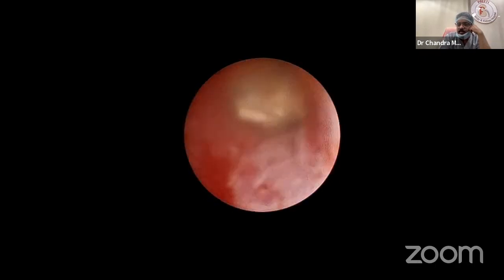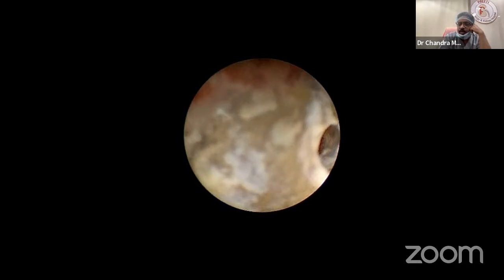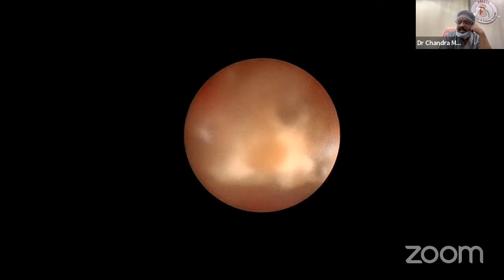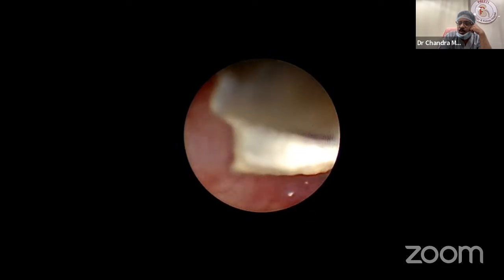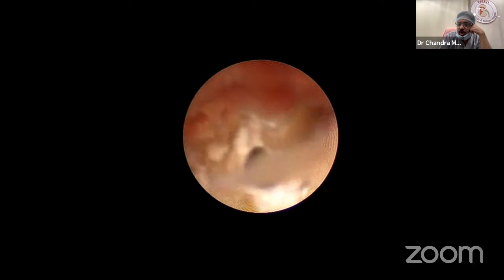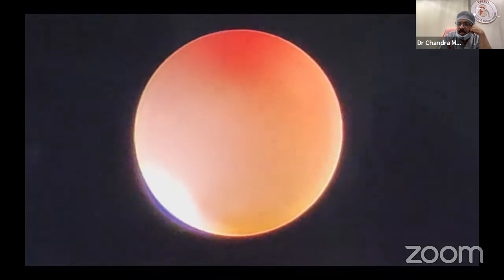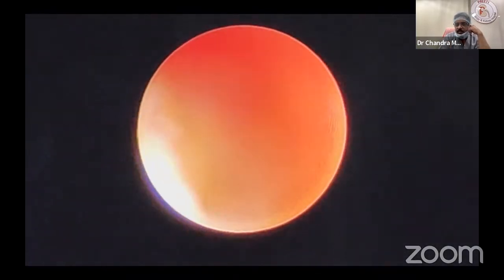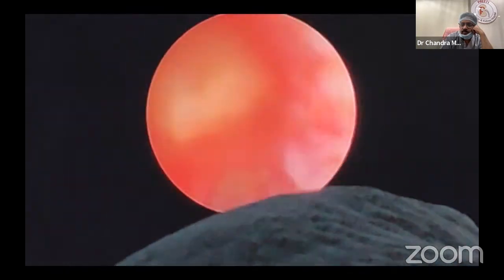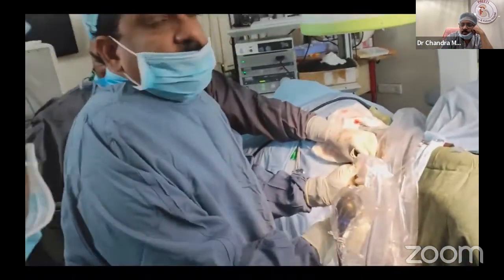That's all. Now I want to take the pneumatic lithotripter, put it in that hole and break it into pieces. You may think, why so much struggling? Can't we easily remove it? No, each case is different. This is a 12 French nephroscope I am telling you. Such a small nephroscope does not show the stone in toto, not even half of the stone is seen. Never damage the PUJ. Laser may be precise, but the PUJ may get damaged. So break it properly with the pneumatic lithotripter.